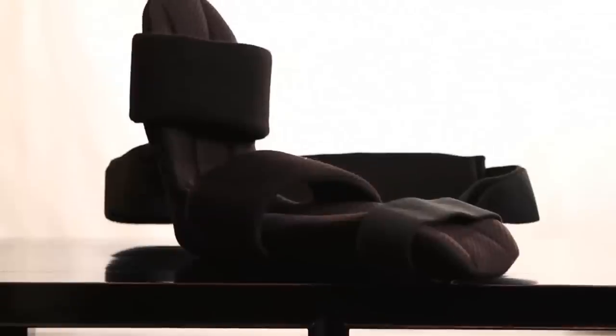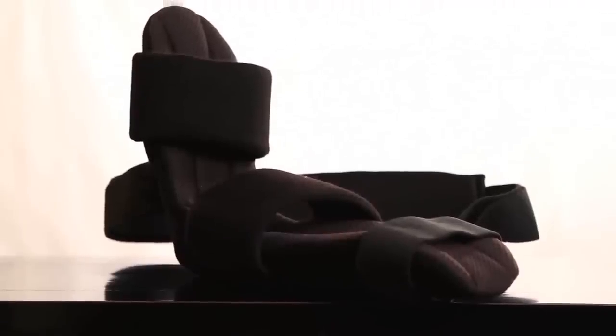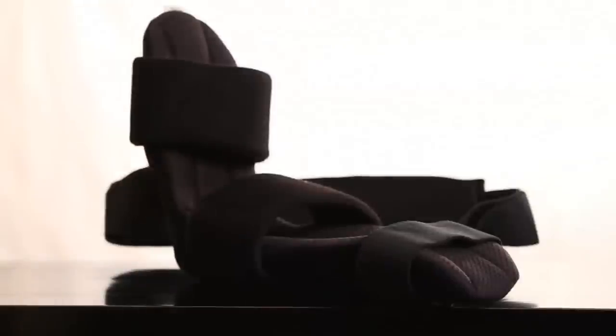The Shoulder Cradle from DonJoy was designed by doctors and engineers with the focus on the patient. By looking at what was missing from current braces, they have created a shoulder immobilizer that maintains the shoulder in the optimal healing position day and night.